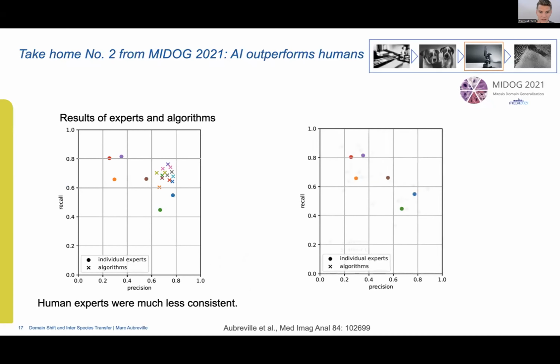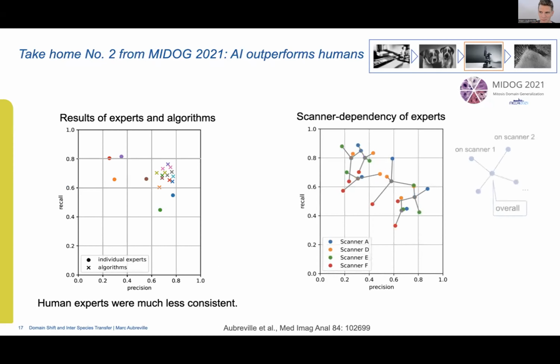All right, another thing that was very interesting for us, and shout out to Katharina Breininger who did this plot here, is how dependent the experts actually are on the imaging device.